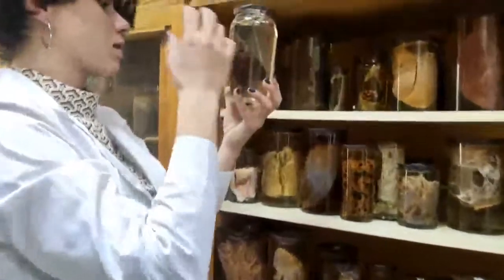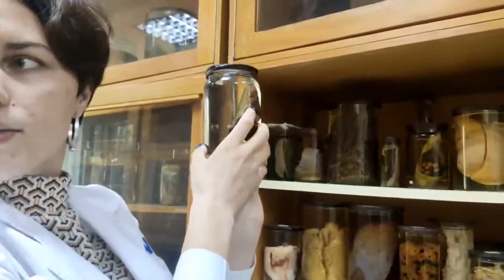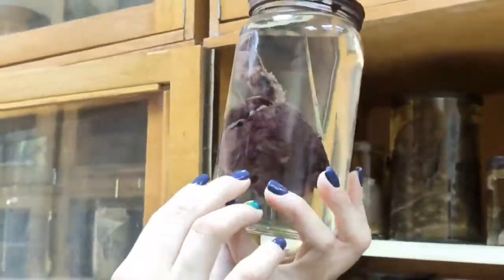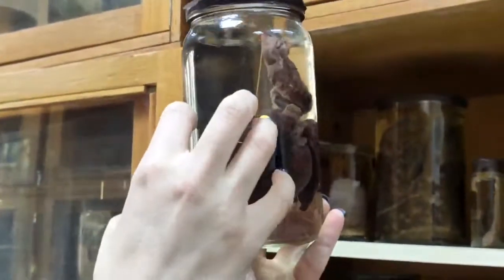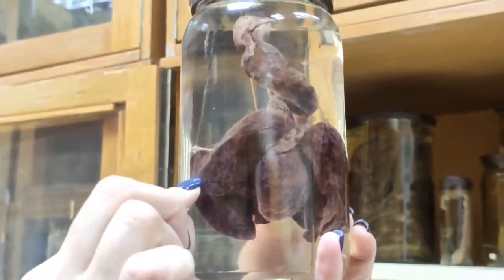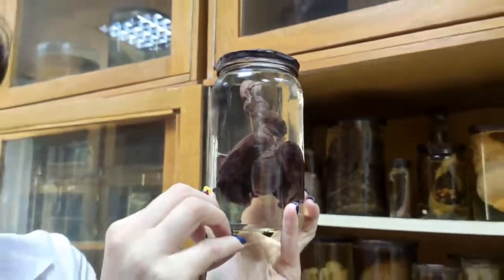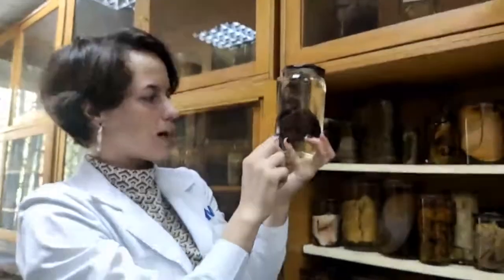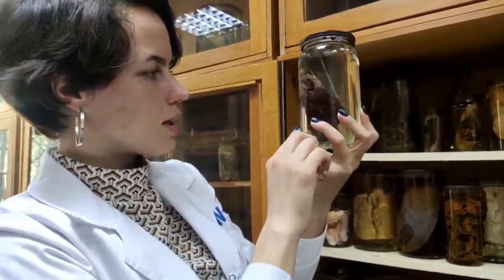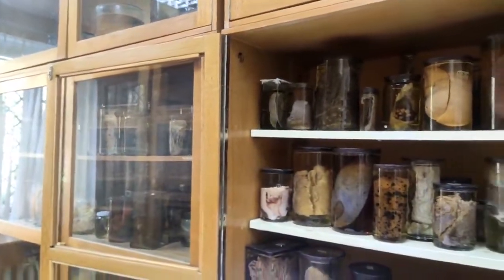What is this? Okay. Here you can see that the lungs are small and they have numerous red spots. Very often in asphyxia, hyaline membranes are developed in the lung because in hypoxia, fibrin starts to go onto the surface of alveoli, and that is why you can see a lot of these hemorrhagic spots also.